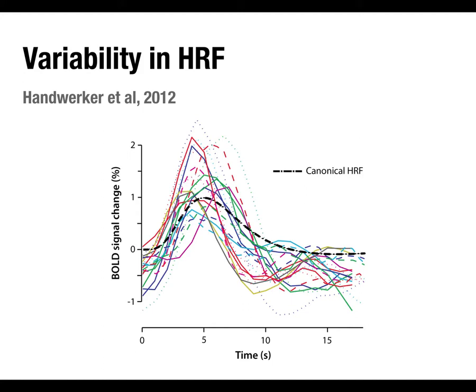And so here, the bold signal change is done in %. And so they've got some baseline, which probably means that before the stimulus came on, they were scanning, they've got something going on. Why it's a little below there at time 0, that suggests that maybe there was just sort of inherent fluctuation in things, yeah. But it sort of illustrates the fact that those numbers are kind of arbitrary. The % signal change is a way of trying to get something quantitative, because at least now we're measuring relative to the baseline, whether that's immediately before, or you've just averaged over the entire scan, and then everything is relative to that average. Could be something like that.